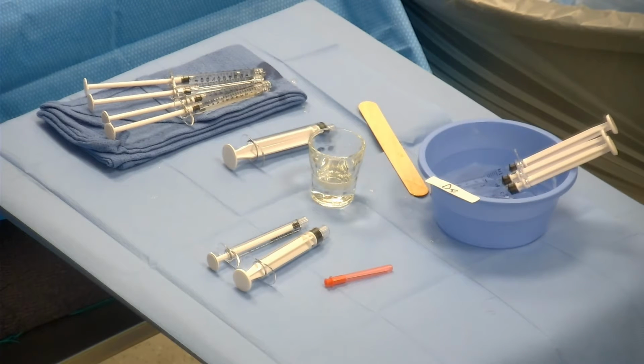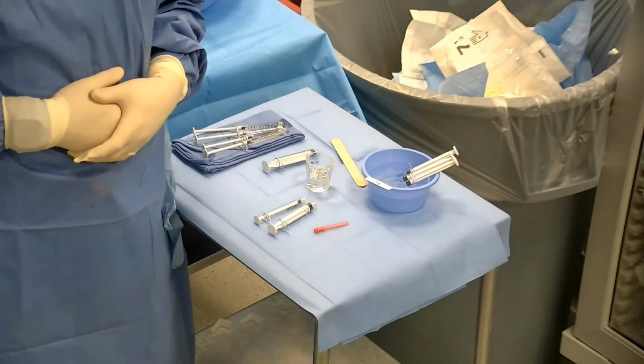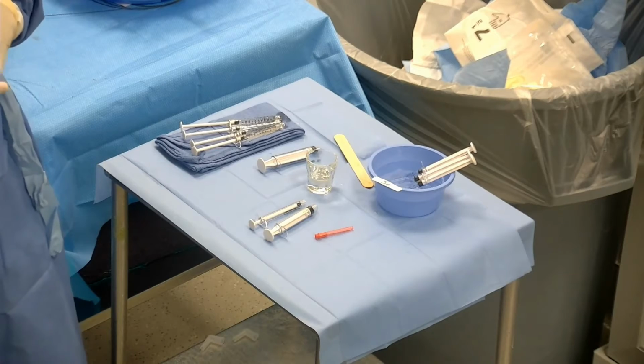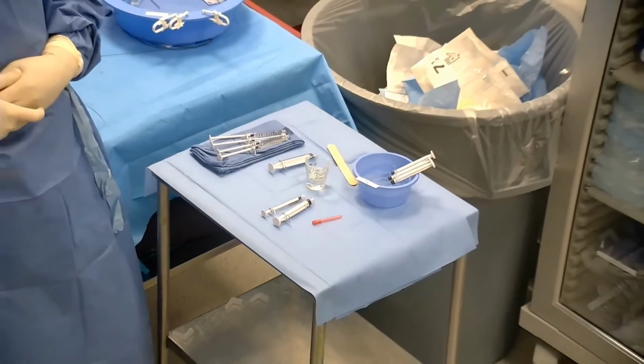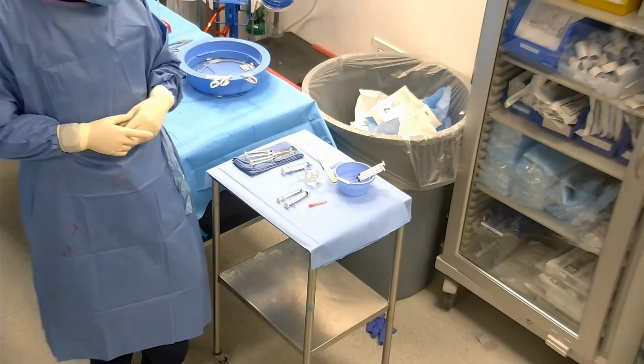There's lots of ways to inject glue, and people that do glue embolization in other territories know this. You could use an aliquot method, or you can just use a push method, which is generally what we do with PAE because we don't want to take too much time switching syringes because we don't have more than a couple seconds before we form a plug.